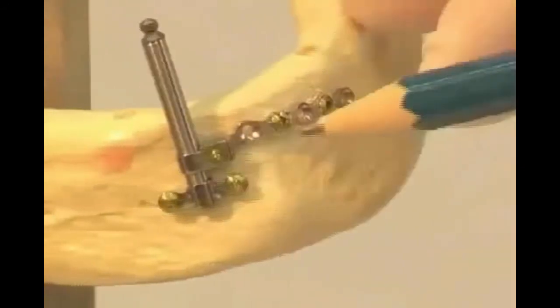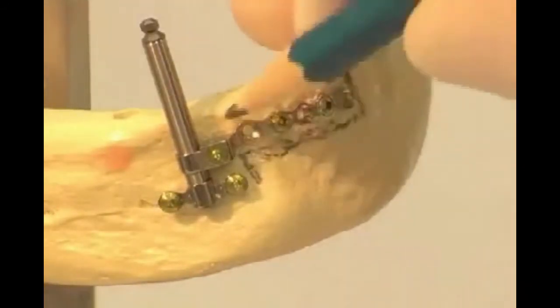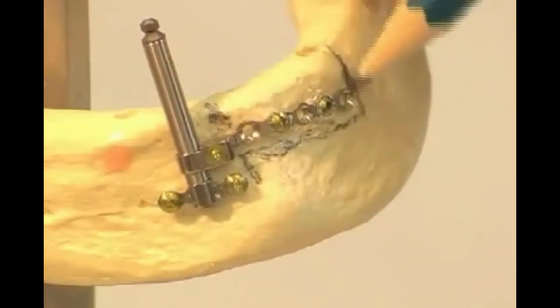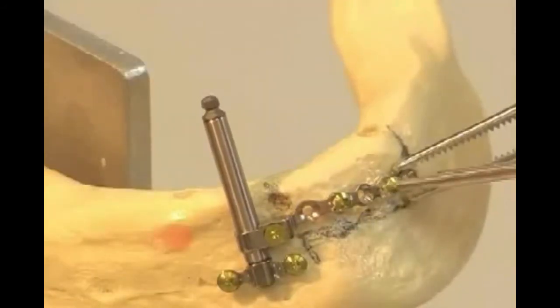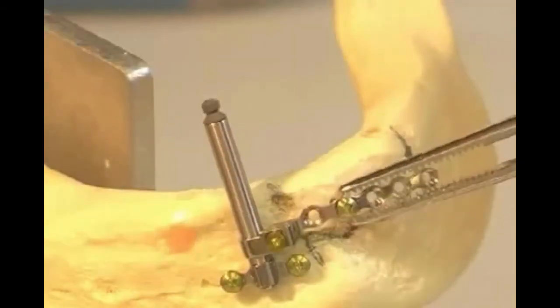At this point in the procedure, we can see how the cut zone is determined, in this case with a pencil. The framed bone block will later be moved upward. This will ultimately correct the jaw defect. After the pencil marking, special pens and mark drillings are also used in the actual mouth. Some parts of the distractor are taken out again.